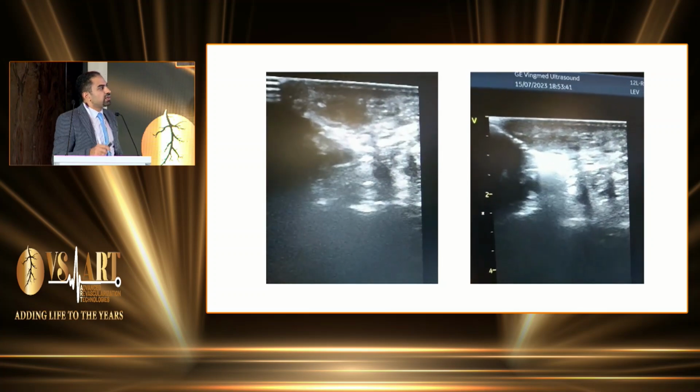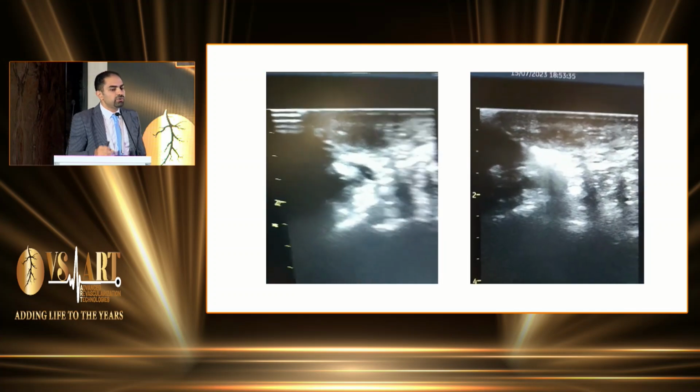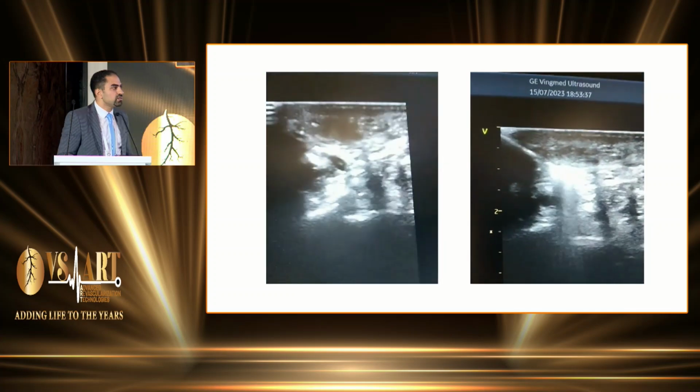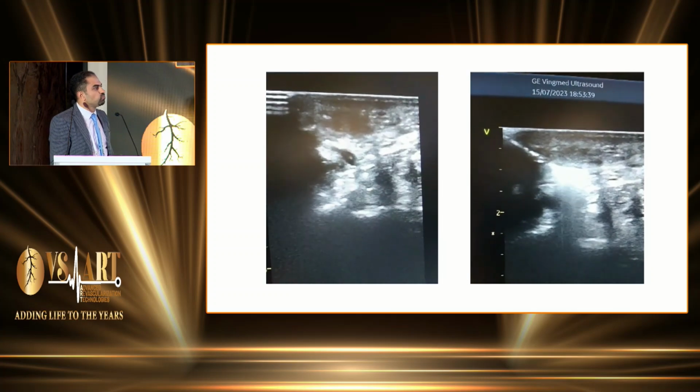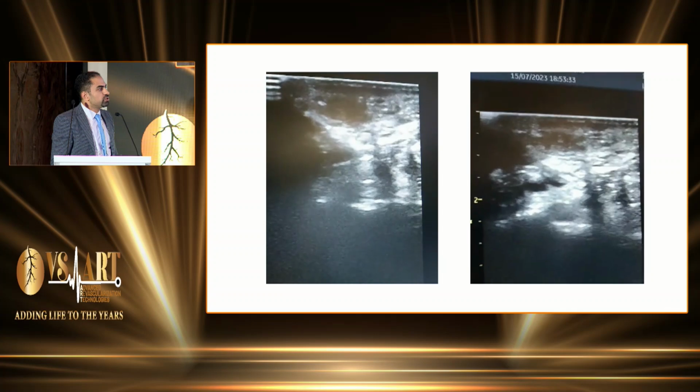Here we advanced the catheter and then withdrew it to ensure that we are far away from the deep veins, and then performed the ablation.